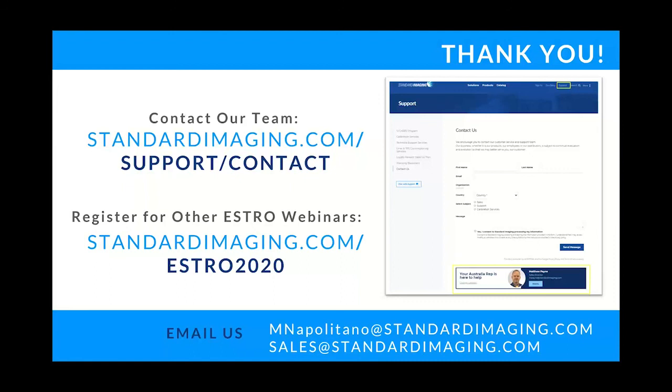As I understand at this point in time, there is no extra charge for that. And so we do then have to create our own log files from the ICOM VX data stream coming from the LINAC for Elekta. And that is the only question that I see at this point.